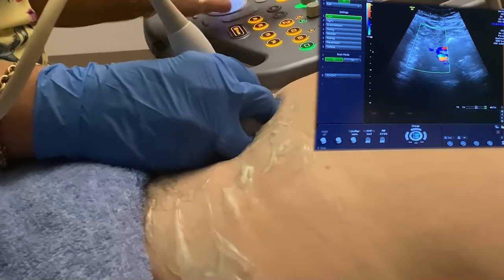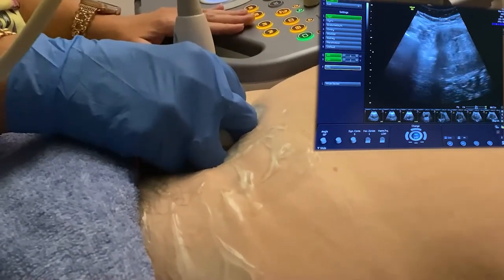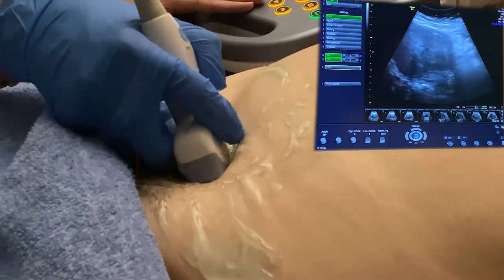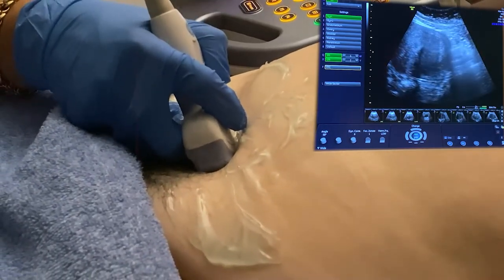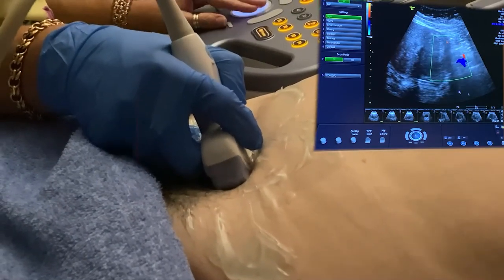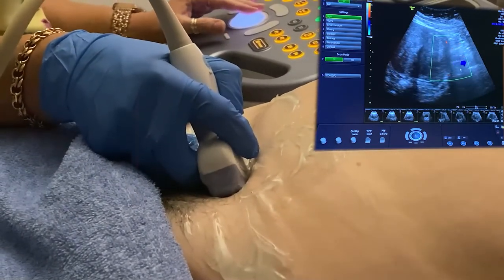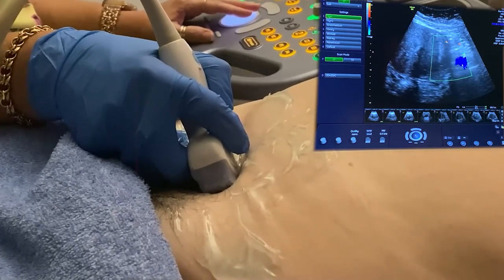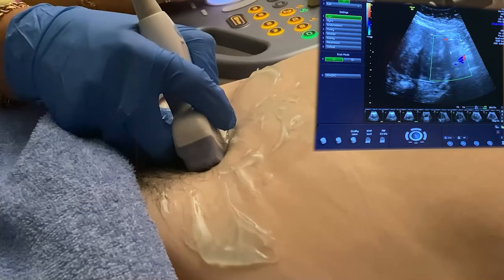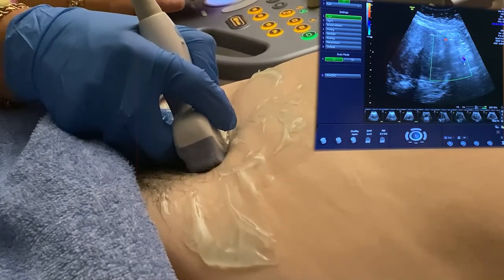And as expected, I don't really see her ovary on that right side, and now I'm going to sweep over to the left and repeat the process here. Again, this is the iliac vessel, the artery and vein, and whatever I'm going to call ovary needs to live in between here, the lateral uterine wall, this space, and those vessels.